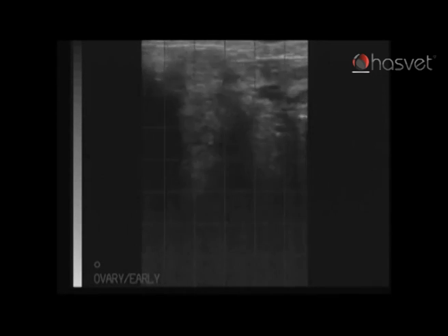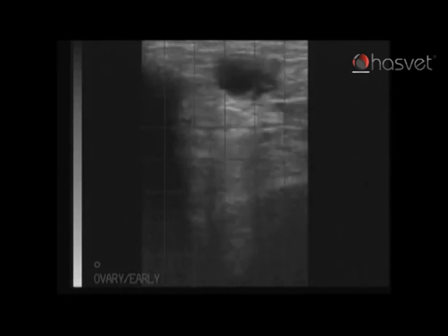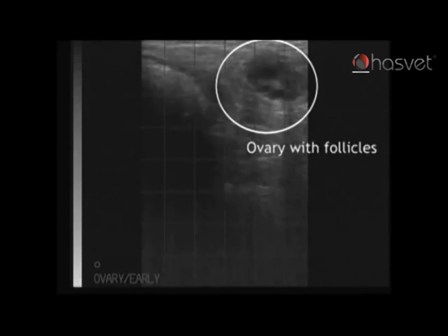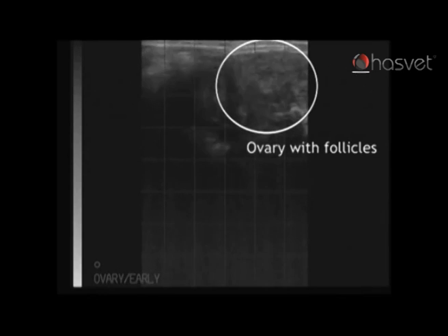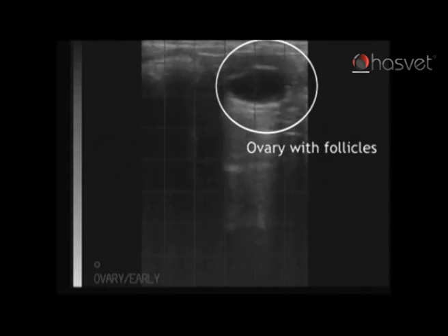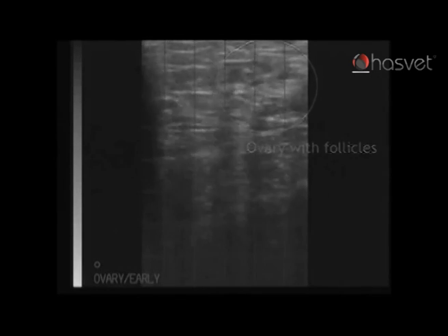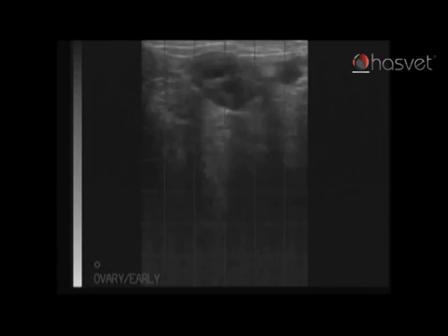We will now evaluate the ovary on this side. It is the spherical structure on the screen just now, and we can see the presence of several follicles — the black, fluid-filled objects visible on the screen.